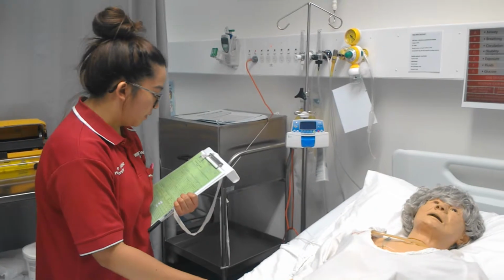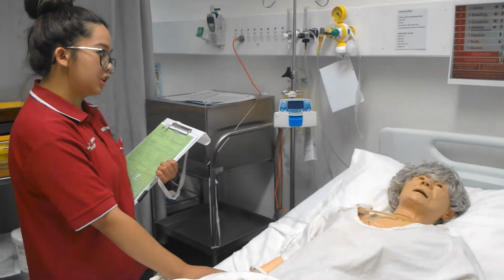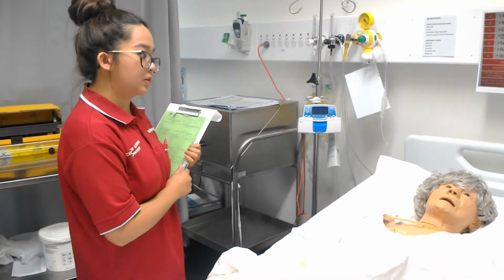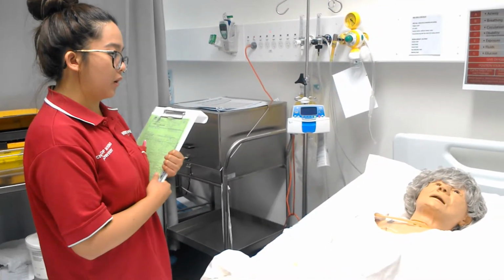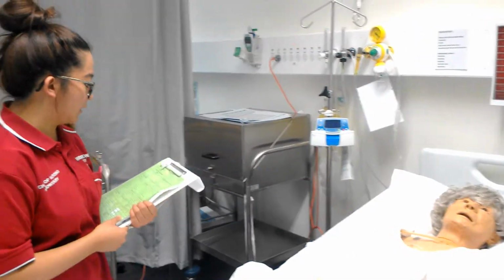Your date of birth, please? 7169. And MRN is 174963. Do you have any allergies? No. Okay, so also I need to double check what your level of pain score is. So 0 being no pain at all to 10 being extremely painful. Can you please let me know how painful you are at the moment? 9. Okay, so I will be giving you that morphine then.